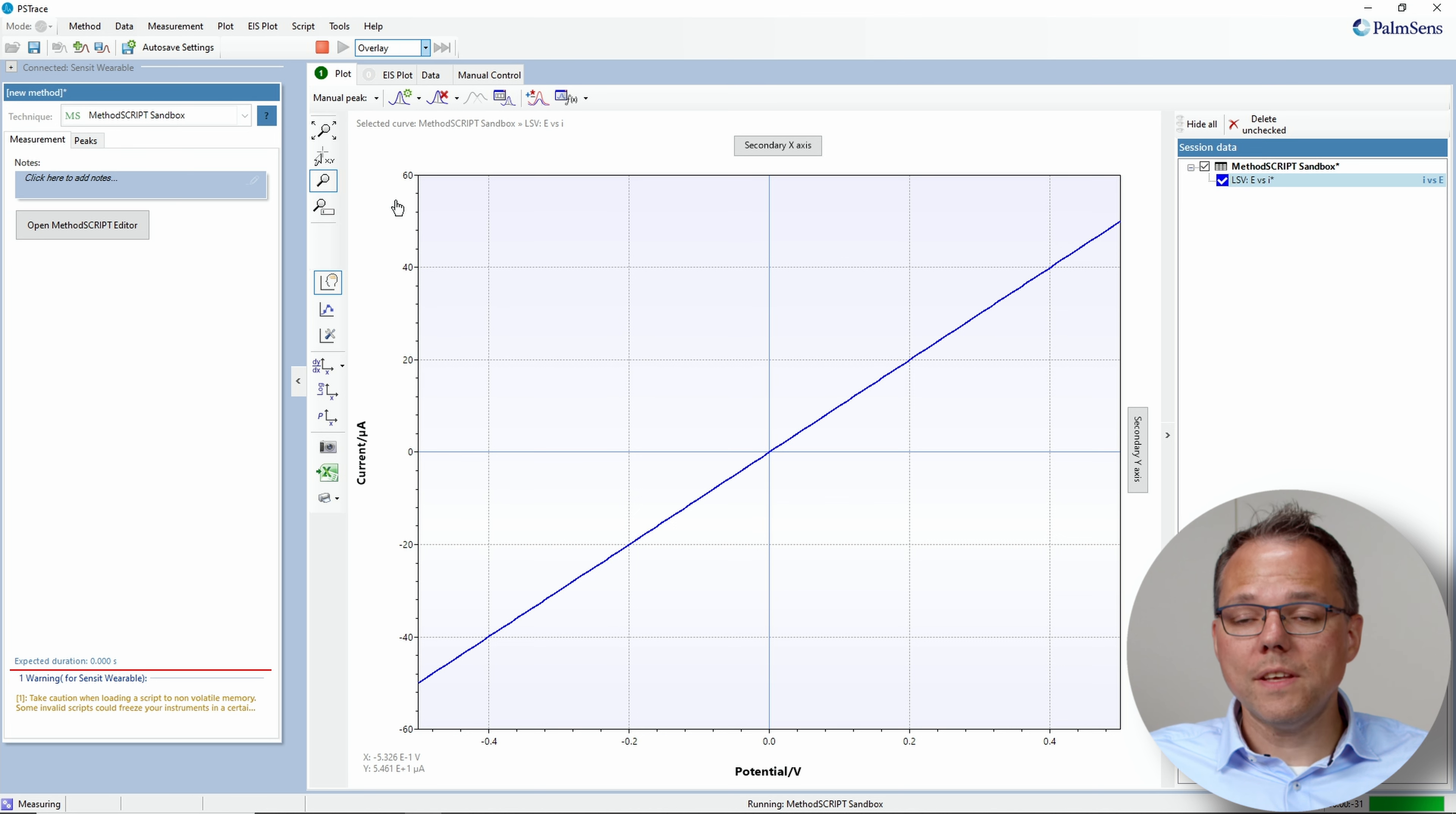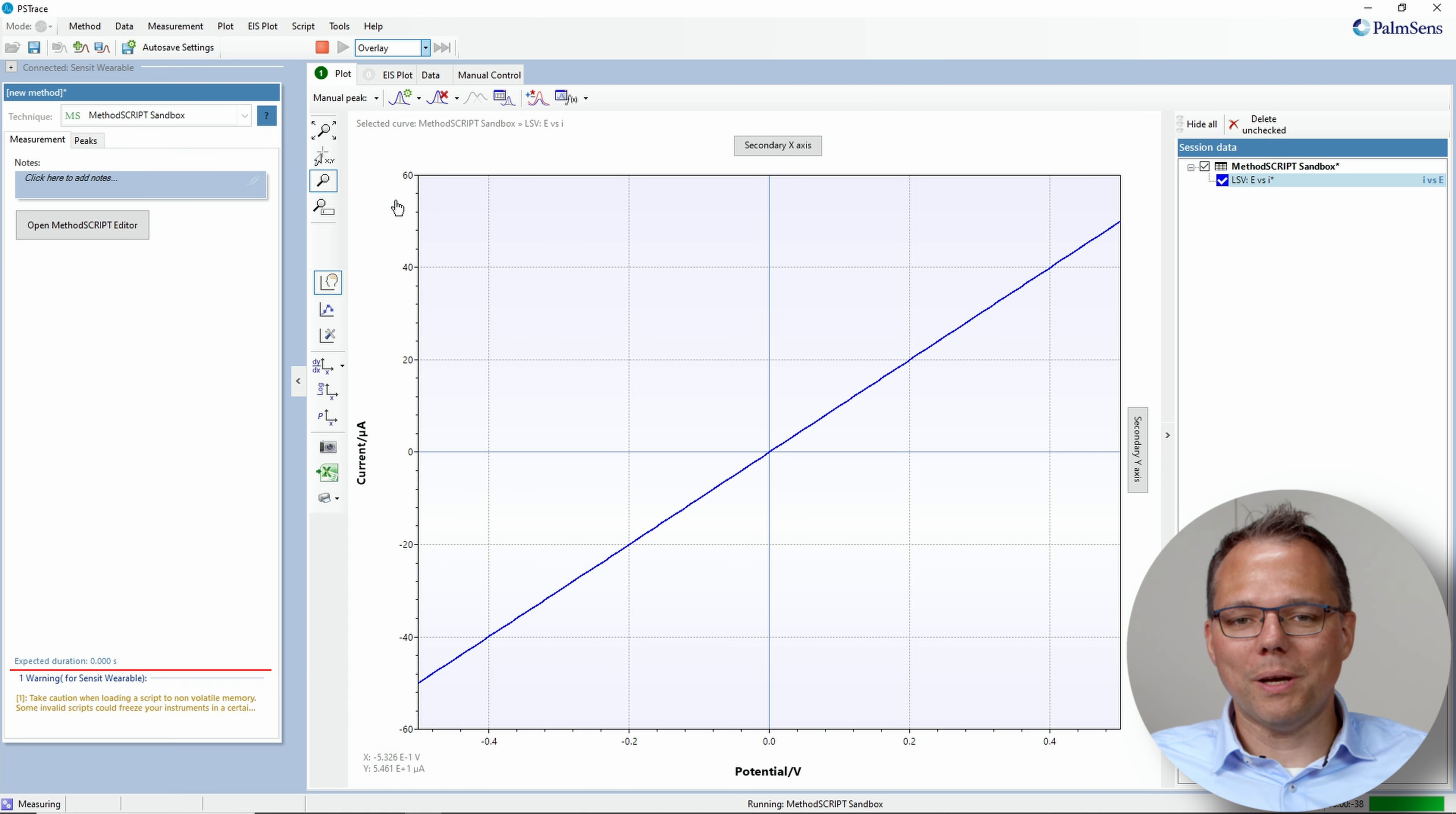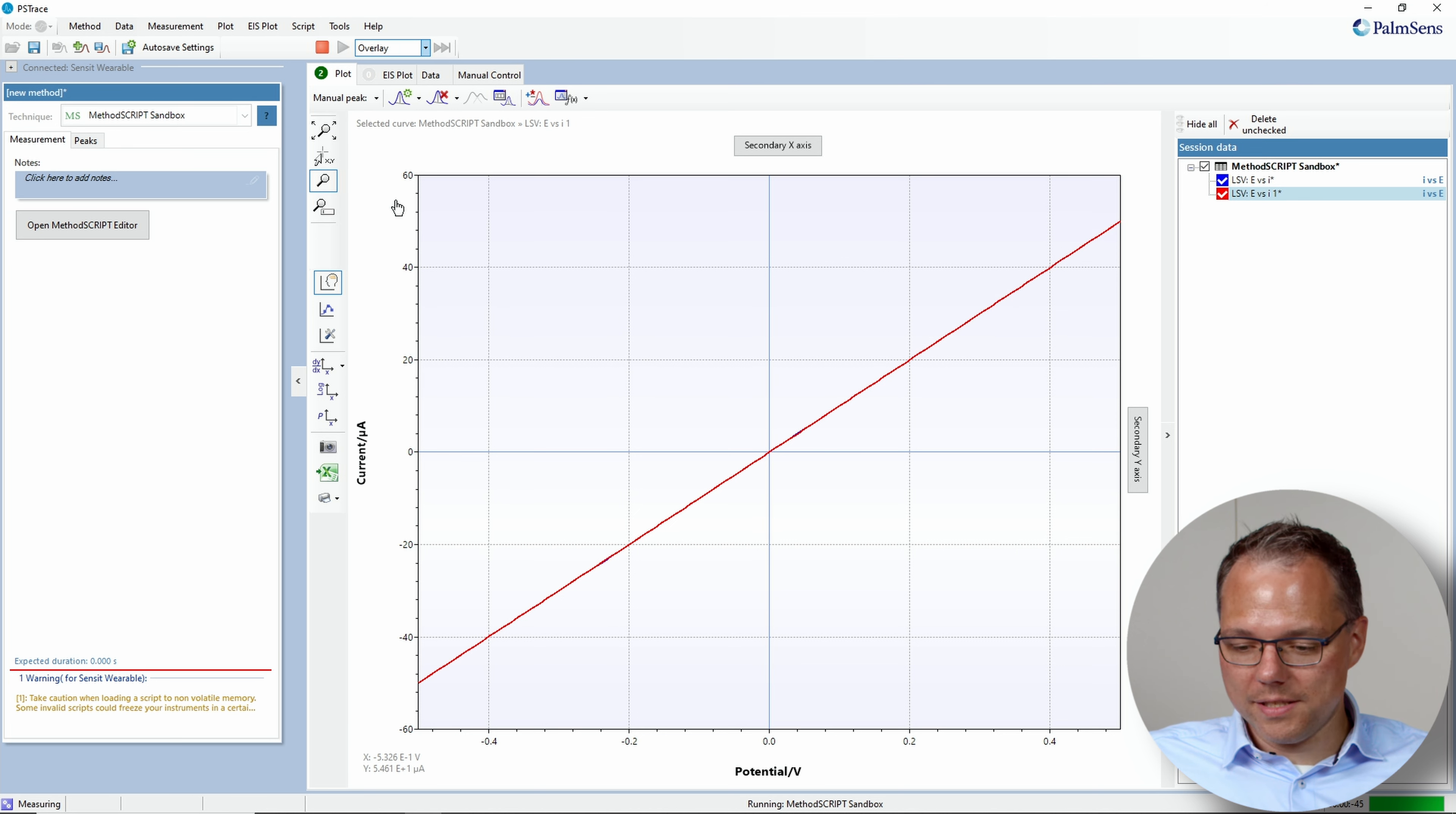And this is repeated every time we push the button. So if I push the button again, it wakes up again and performs the measurement again. This way you can perform the measurements on demand.